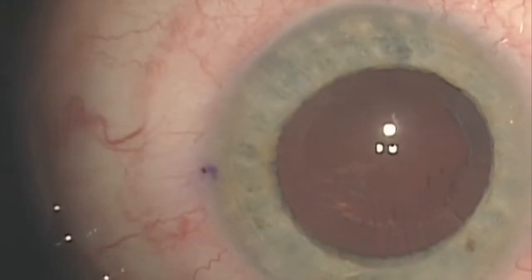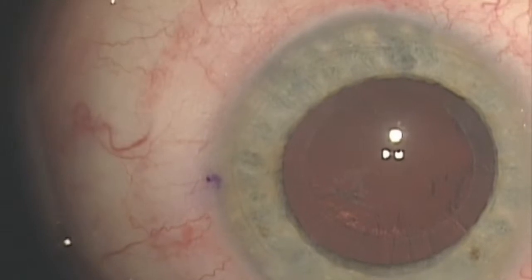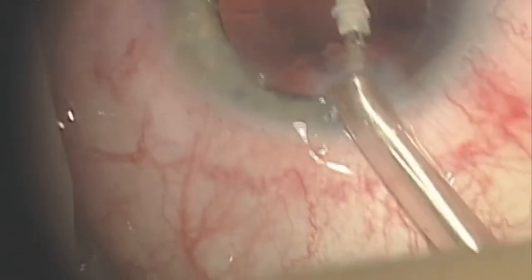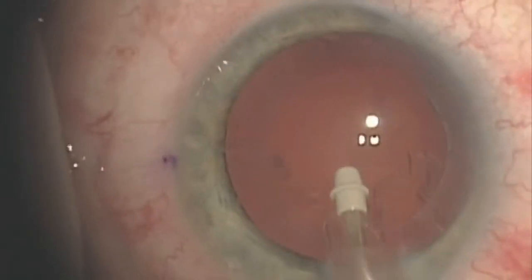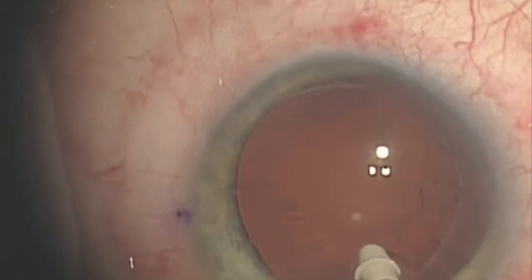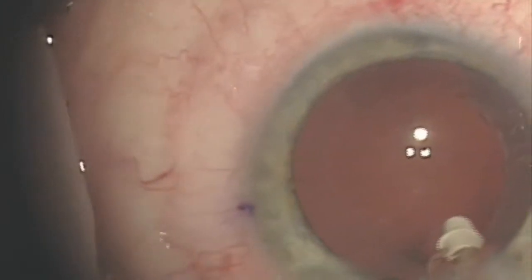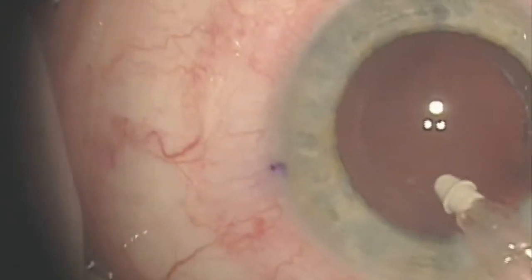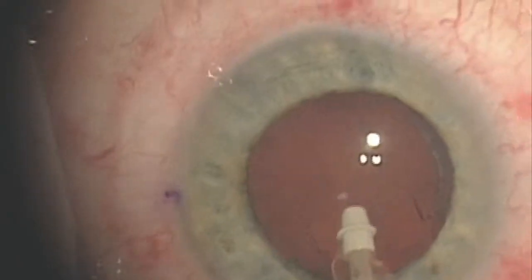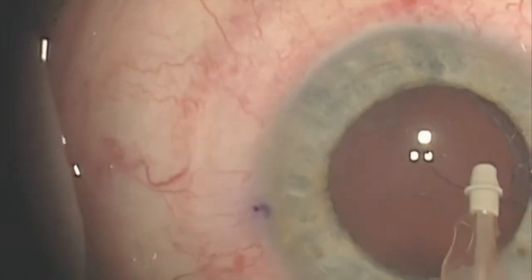Ms. Carlene is back here getting my second handpiece available. This is a different opening, a different setting on the machine, and that white fluffy material is what we call the cortex. That's surrounding it. By the time I finish with this, you're not going to see it fluffy, it's just going to look like a big old red. Alright, so let me just finish. When you have a laser, this part can sometimes be a little trickier, getting what we call the cortex out. But this is coming along just perfectly.